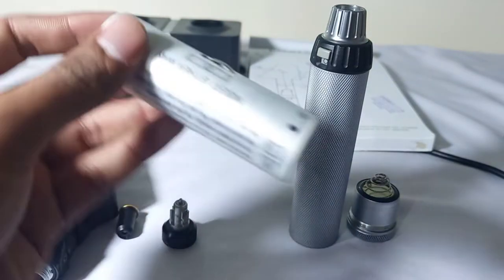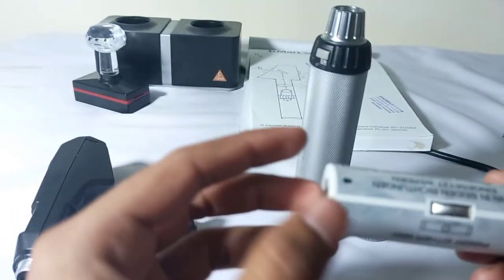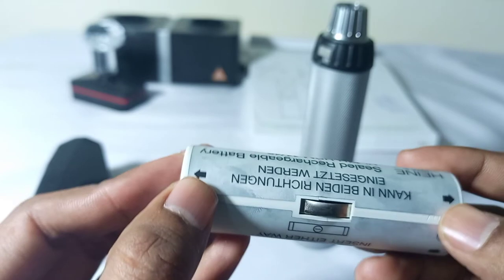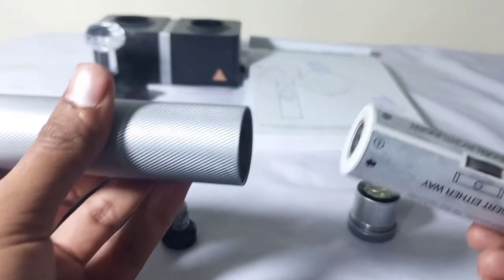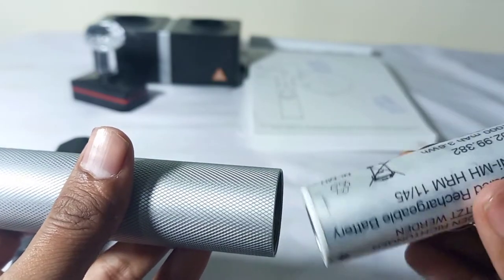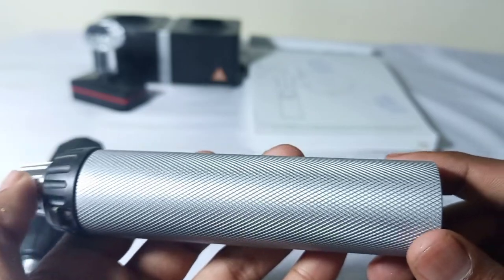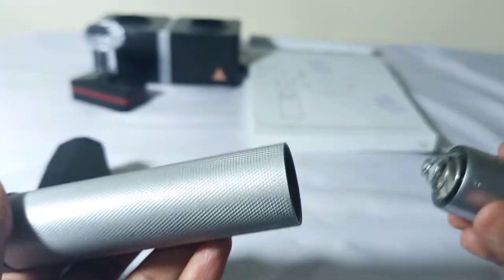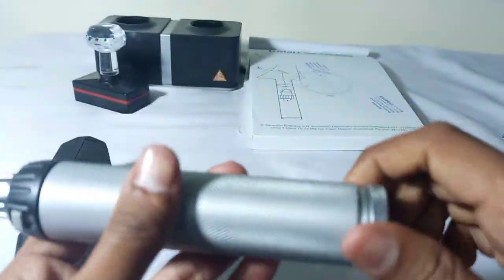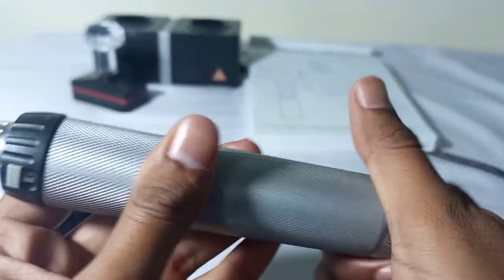First of all you have to put the battery into the handle of the retinoscope. These two arrows indicate that you can put the battery in either side — this way or this way. I am putting the battery inside the handle and then this cap is to fix the battery inside the handle. So we have fixed it.